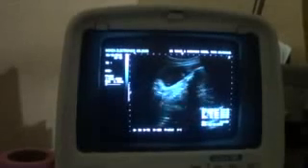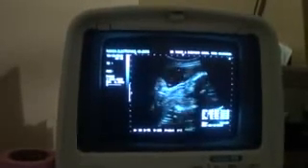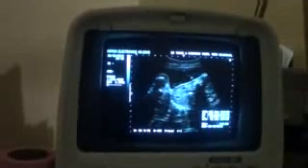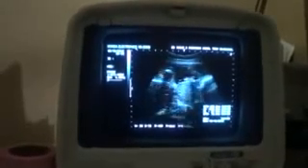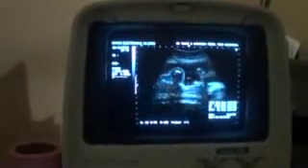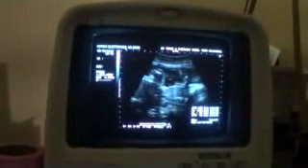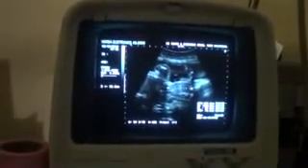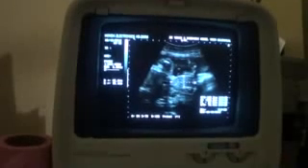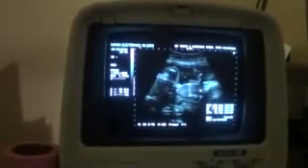Head of the fetus. Here we come towards the spine, the neck region, and in the neck region, between the neck and the cephalic portion of the head, now, this is a solid mass seen at the neck region. This one. This is a mass measuring approximately 4.2 by 1.91 centimeters.